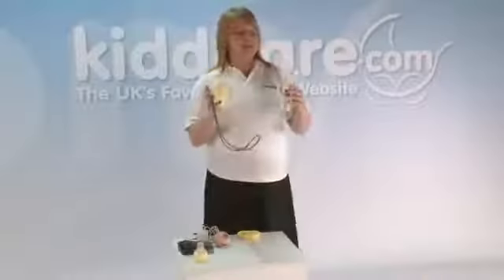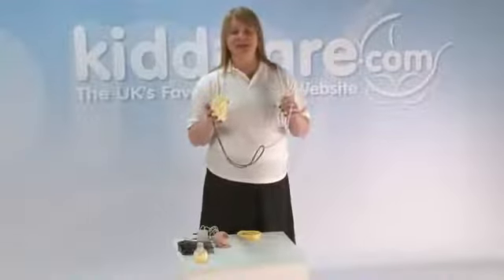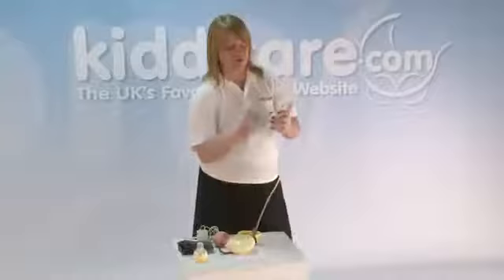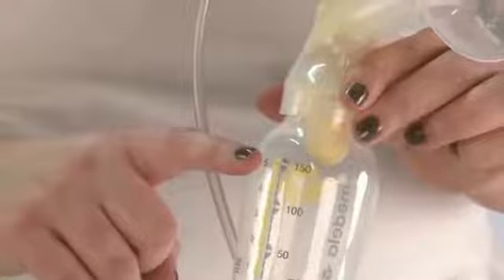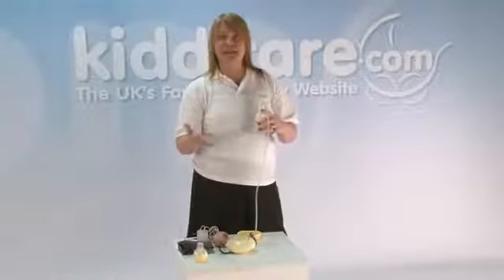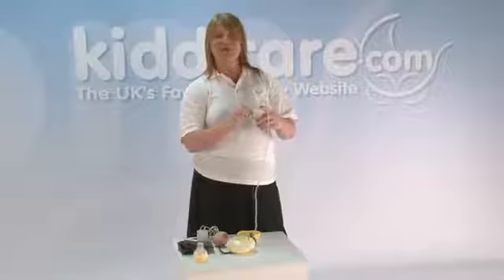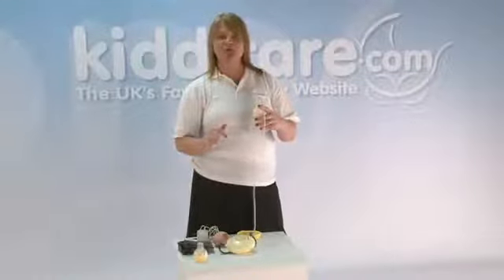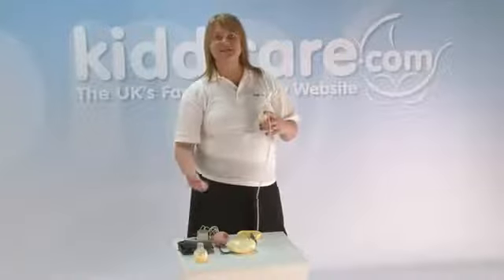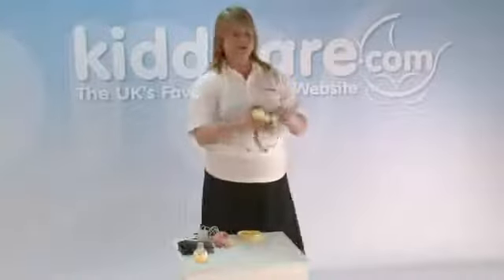It's always really important as well to be upright when expressing. If you lean or tip, and overfill the bottle past the valve, the milk has to go somewhere, and you increase the risk of milk backtracking down the tube. Now, this rarely happens with our pump and shouldn't happen if used properly, but if you do overfill past that valve, you do increase the risk of milk backtracking. If that happens, the pump isn't broken, it still works efficiently, and you can clear that through the pump. I'll show you how you do it.